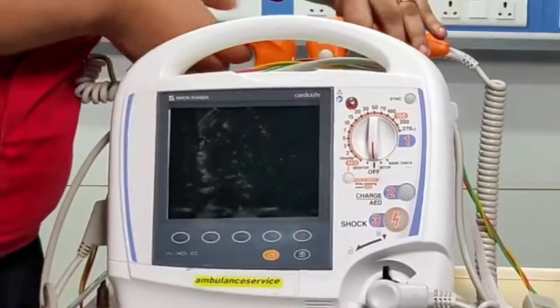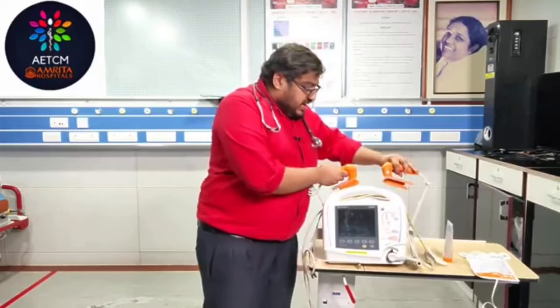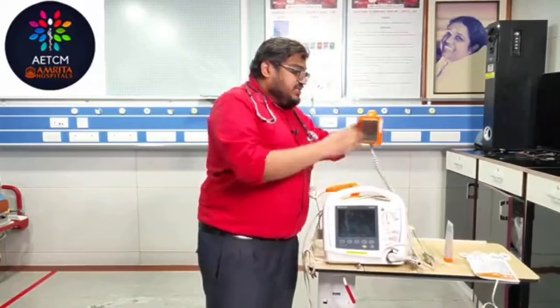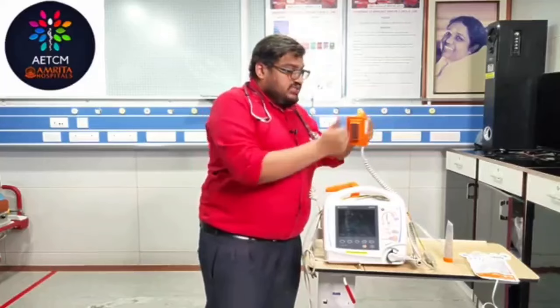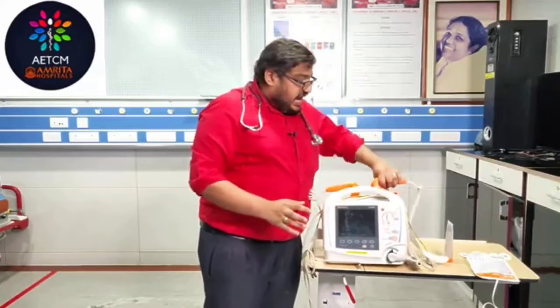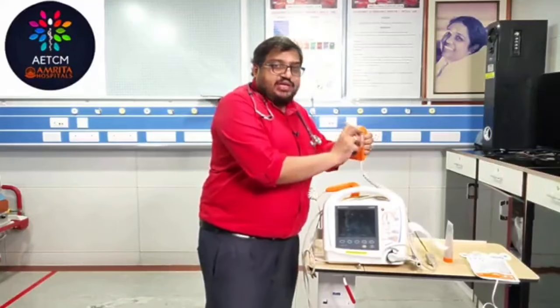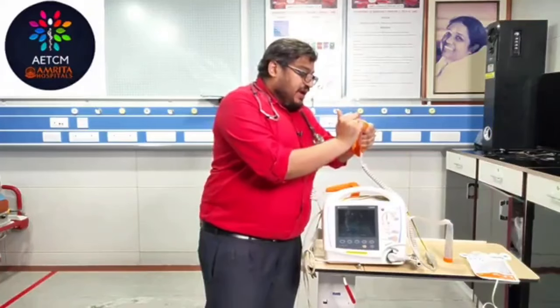Then you will have two paddles here. One paddle you need to keep over the right side of your chest and one paddle over your apex. And you can see something here. This is the pediatric paddles. When you flip on this side, you will be able to see the pediatric paddles. And in pediatrics, the dose is 2 joules per kg for your defibrillation. So when you are planning to go ahead for a pediatric age group, you have to remove this and use this paddle. So this is the pediatric paddle.